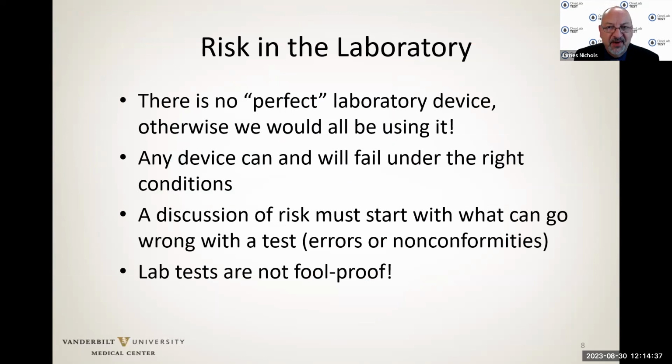When we talk about risk in the laboratory, we have to all realize, and I think many of us do from the experience that we have working with laboratory tests, that there is no perfect laboratory device. Otherwise, we'd all be using it. We don't have Star Trek tricorders sitting around that are non-invasive and perfect and test for everything under the sun.